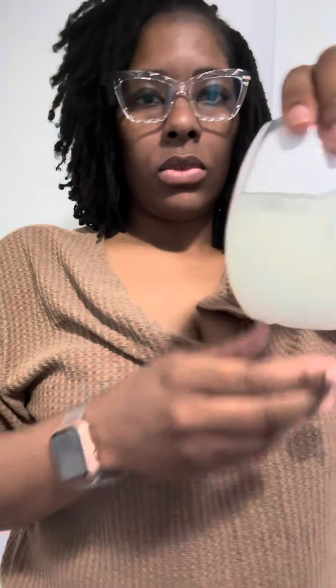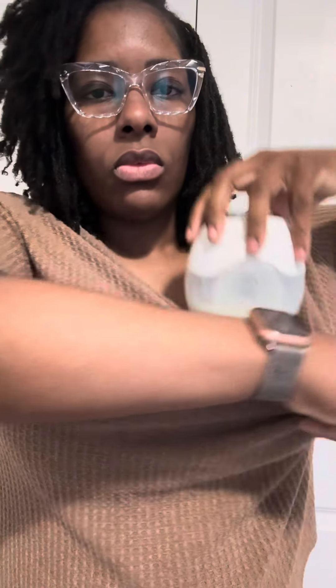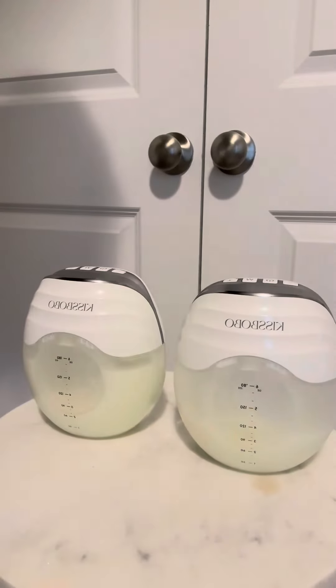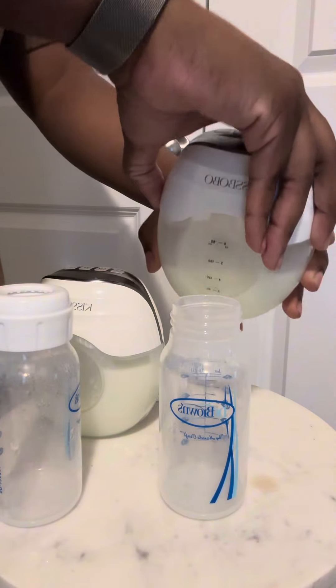The pumping window is actually not 30 minutes — it's about 18 to 20 minutes, and as you can see, I'm still producing consistently the same amount that I would in a normal situation. Even baby girls are excited about it.